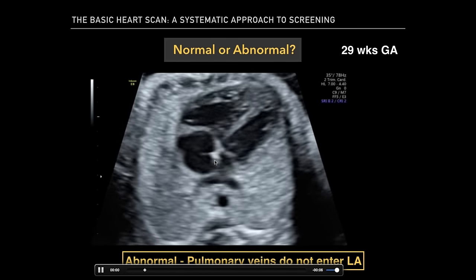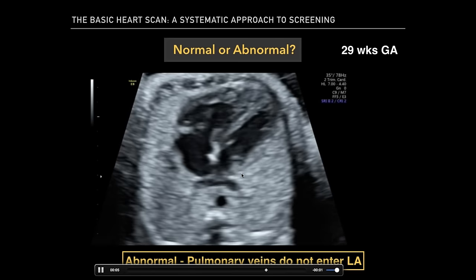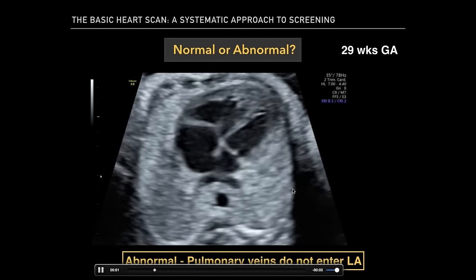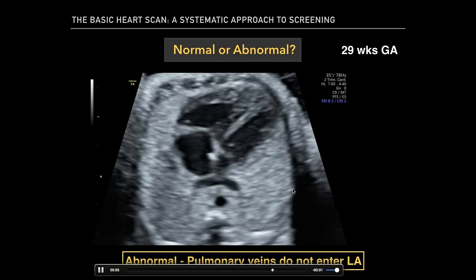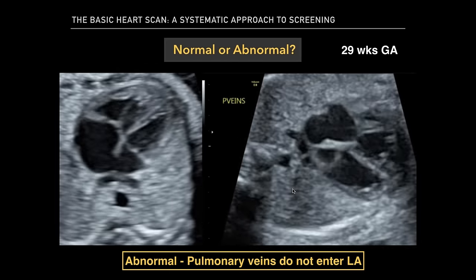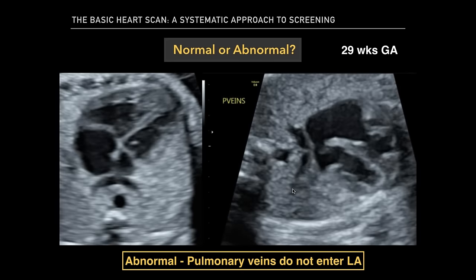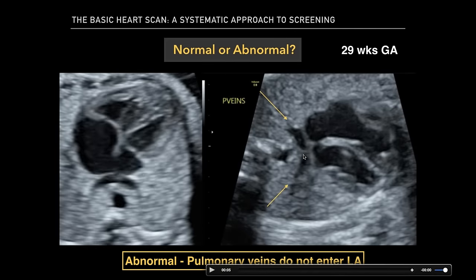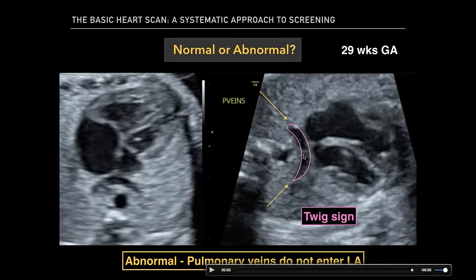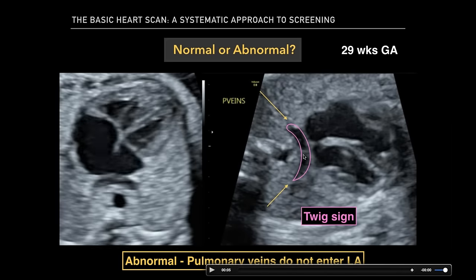Also the slightly enlarged right side of the heart, and also slight bowing of the left atrium. So this obviously is abnormal. There are no pulmonary veins that enter the left atrium. And just going from the subcostal view, in order to view this area clearly, here we could actually see the confluent vein. This is otherwise known, based on studies, as the twig sign.